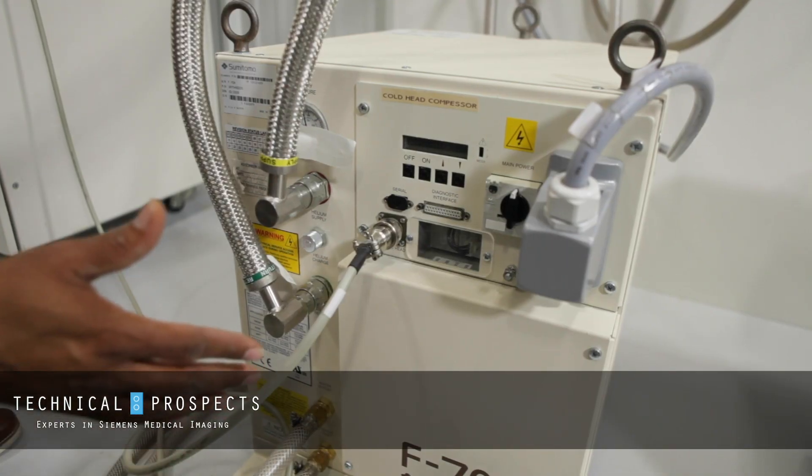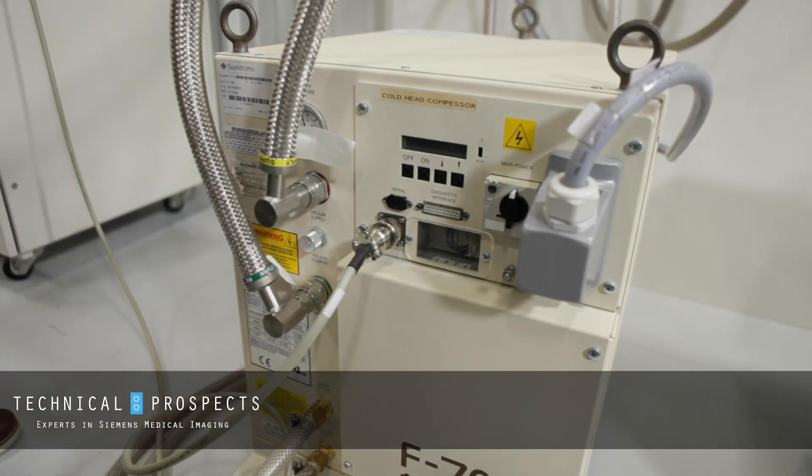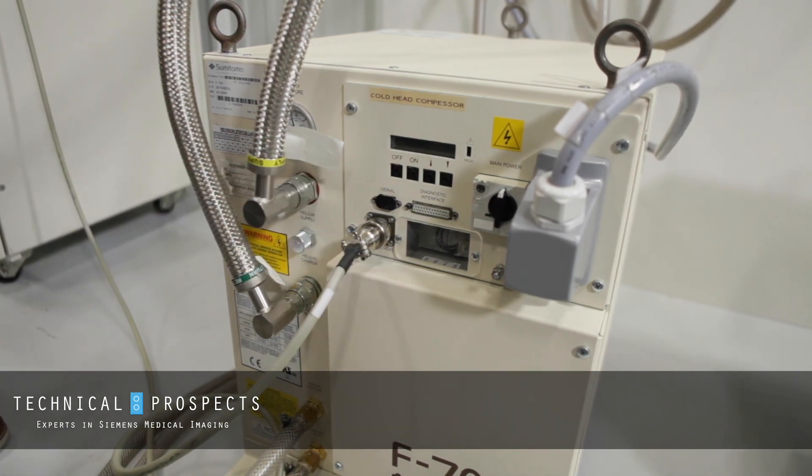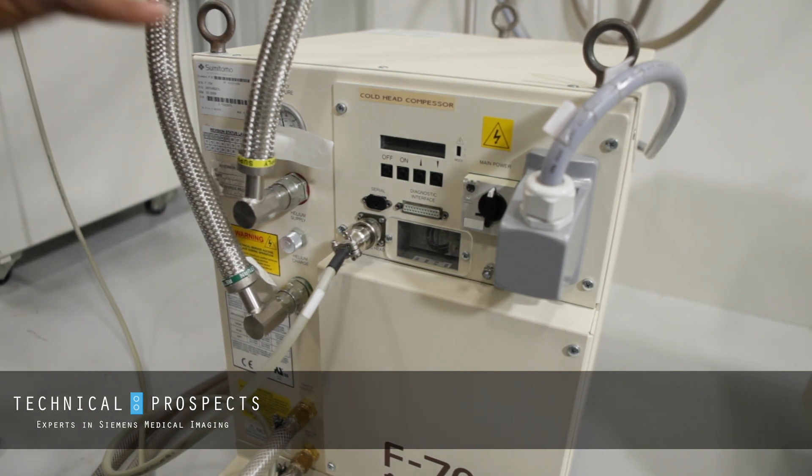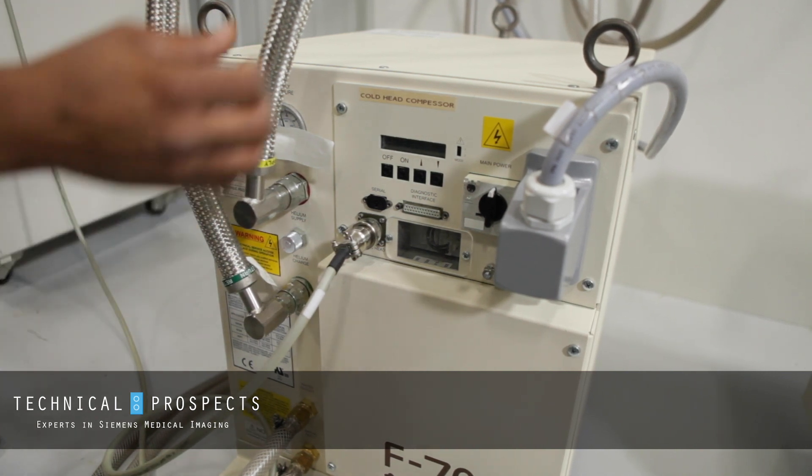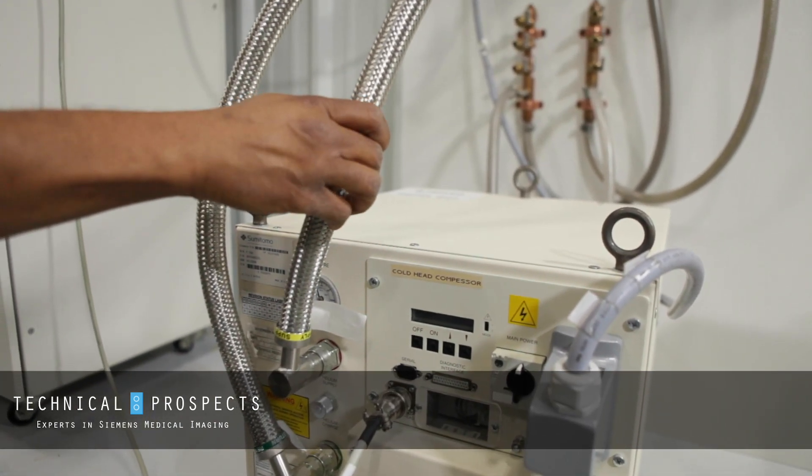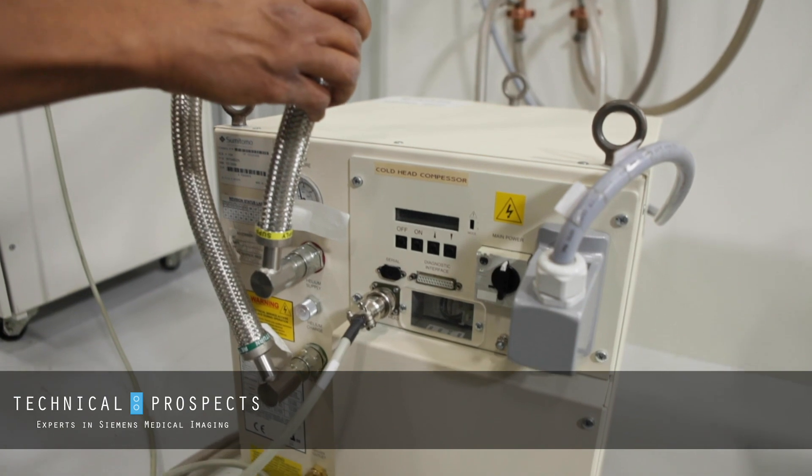With the F70 compressor, as I stated, you must replace the absorber every two years. And also if your timer reaches 20,000 hours before that two years, you must replace the absorber at that point, because these lines can become contaminated. If they become contaminated, we'll start having trouble with our magnet cooling system.